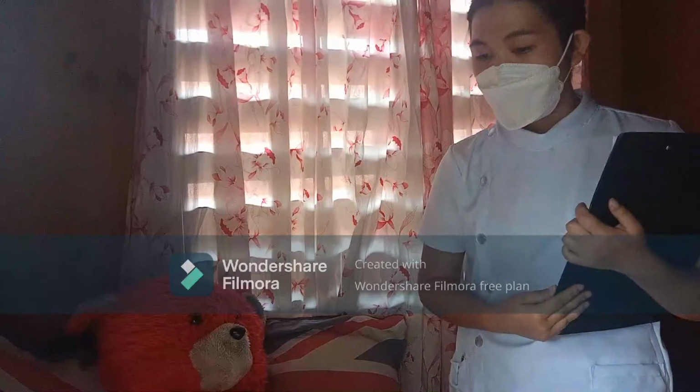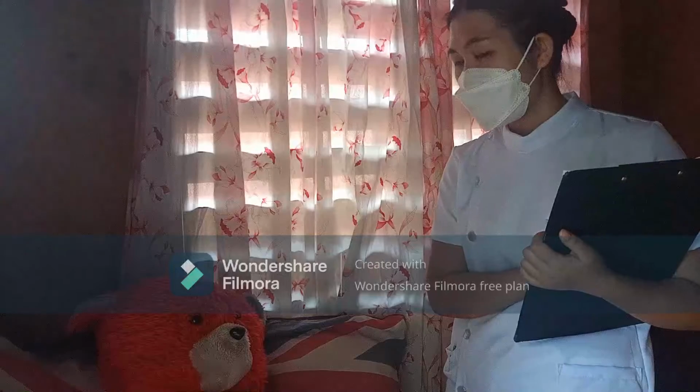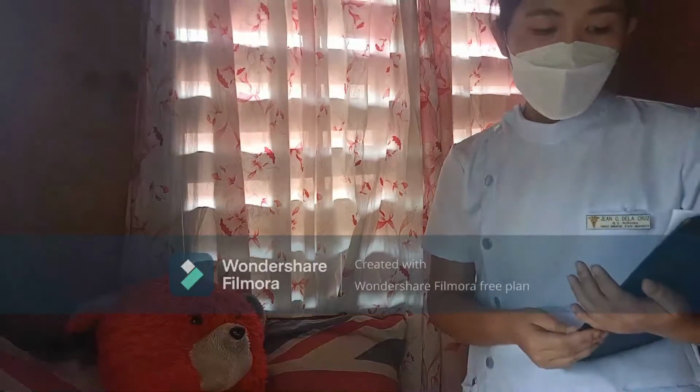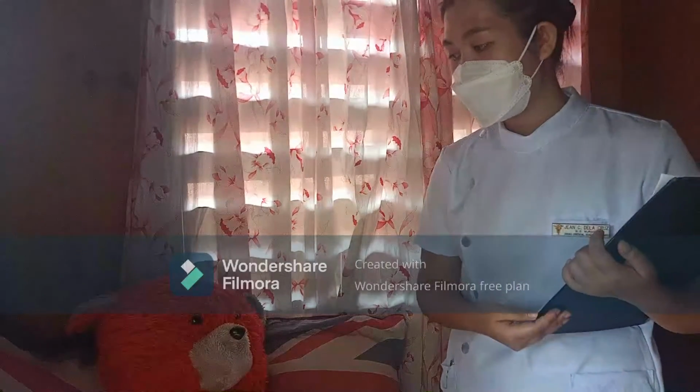Okay, so may I know how you are doing today, ma'am? How was your stay here in the hospital? Okay, that's nice to hear that from you, ma'am. So, by the way, I am here to inform you that I will be performing the nasogastric tube insertion.